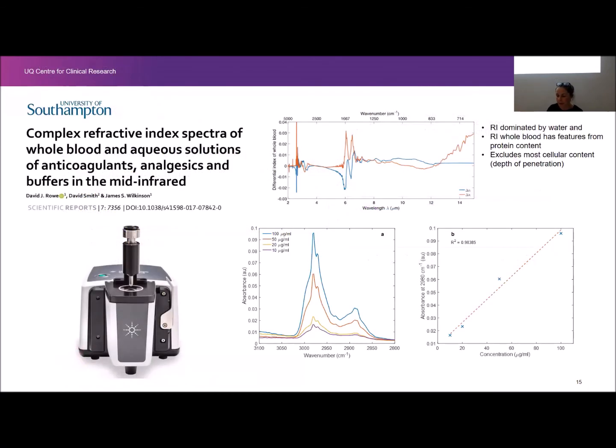But as far as bioanalytics goes, one of the areas for TDM is the measurement of concentrations bedside. And to be able to do this would be a game changer, and I think people would be greatly interested in seeing this being able to be done. And I've got 2 examples here of groups who are trying to bring this into the clinic.